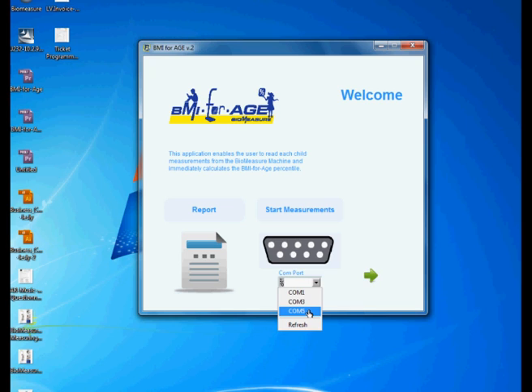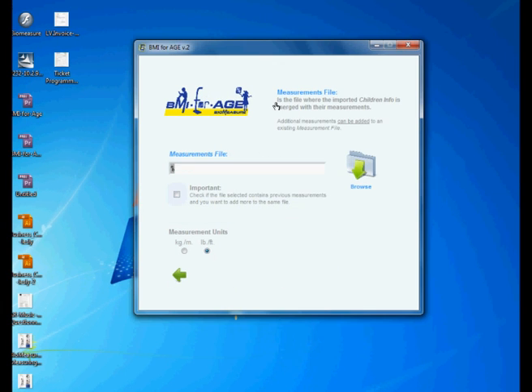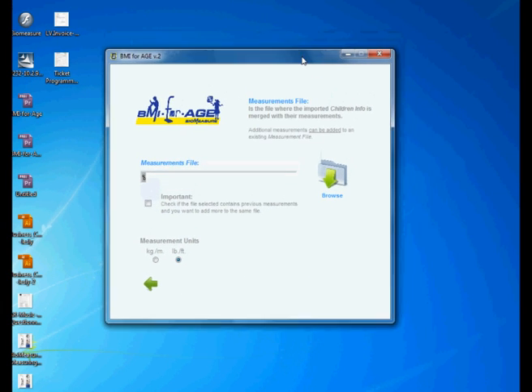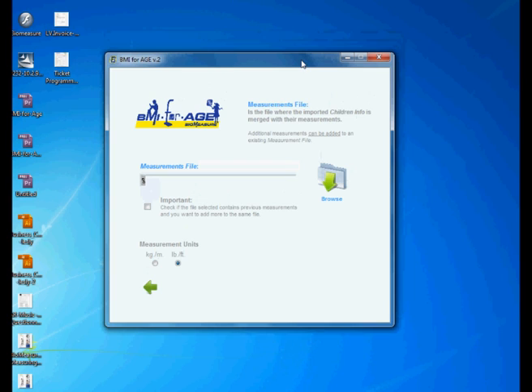In this case I know it's COM5, so I'm gonna select COM5 and click next. This is a very important window. I am going to try to explain it the best I can. Number one, I want to define what is the measurement file. This is a file where the children information is merged with the measurements.